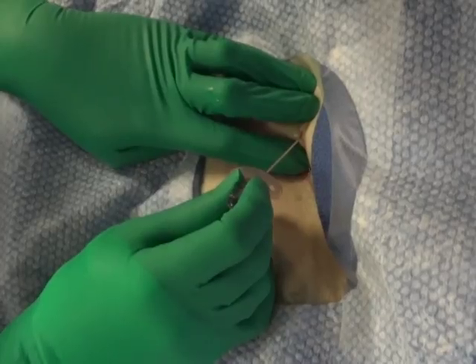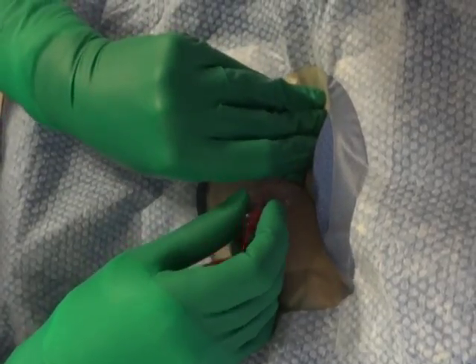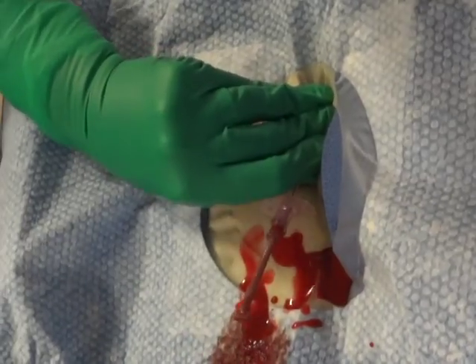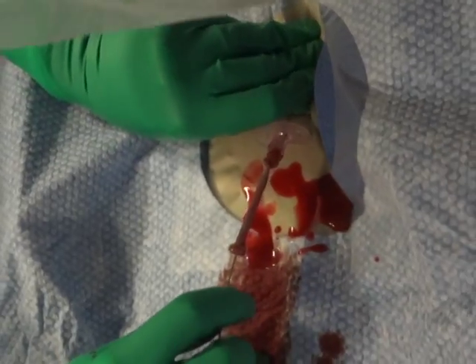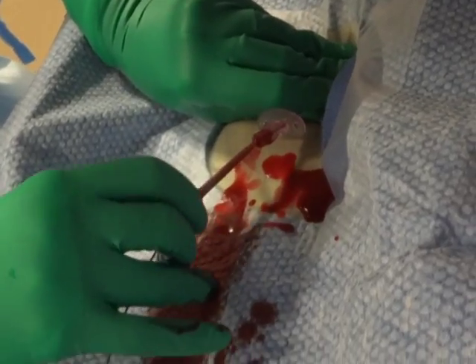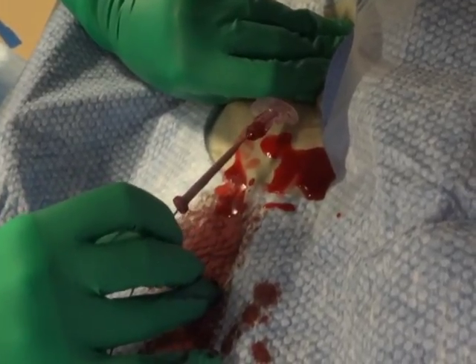If you do not see brisk pulsatile blood return, it may be because the lumen of the needle is not in contact with the lumen of the artery. In this case, the needle should be withdrawn and pressure held. Once the needle is successfully inserted, advance the guide wire through the needle and into the artery. You should be able to advance the wire smoothly. If you feel resistance at any point, you should remove the wire and reconfirm flow through the needle, as resistance may be due to an arterial dissection.